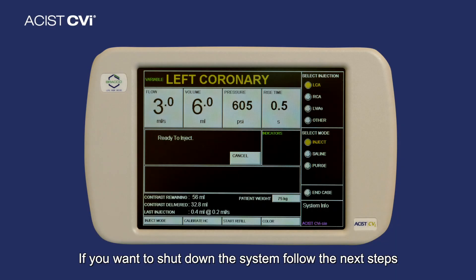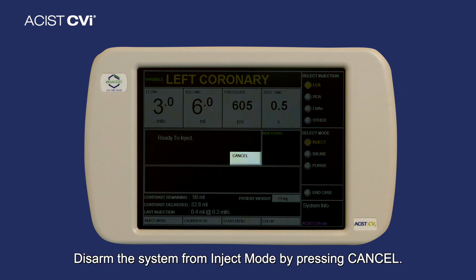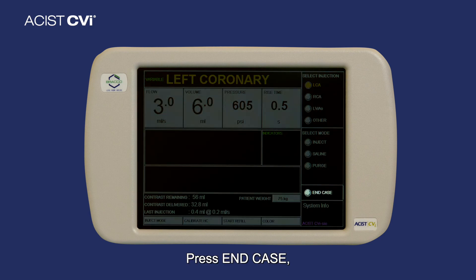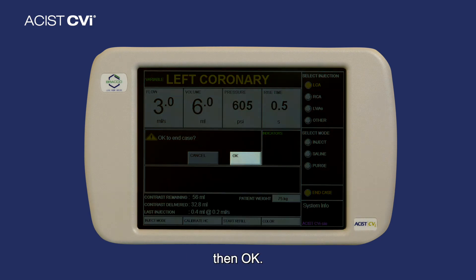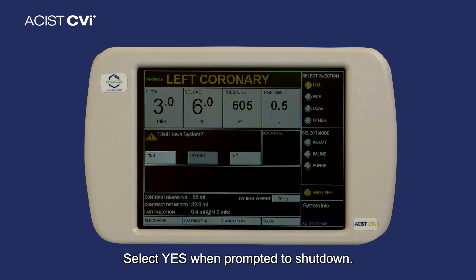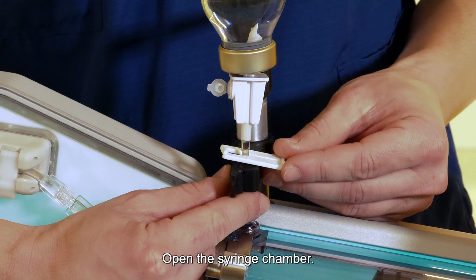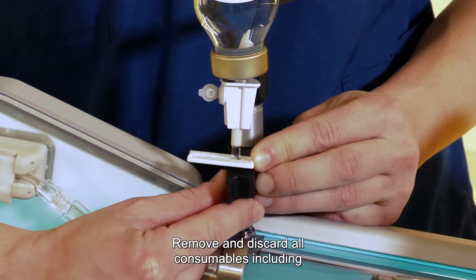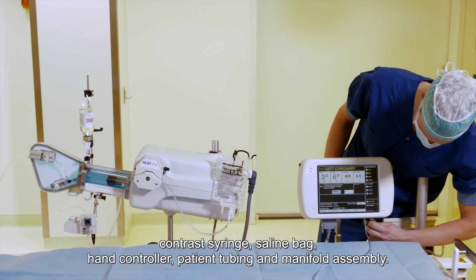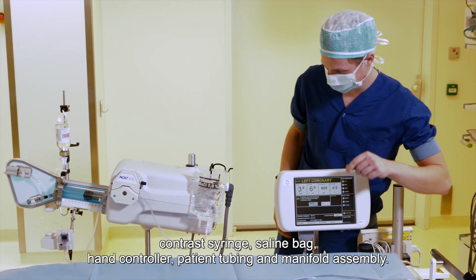To shut down the system, follow the next steps. Step 1: disarm the system from inject mode by pressing cancel. Step 2: press End Case, then OK. Step 3: select Yes when prompted to shut down. Open the syringe chamber, remove and discard all consumables including the contrast syringe, saline bag, hand controller, patient tubing, and manifold assembly.